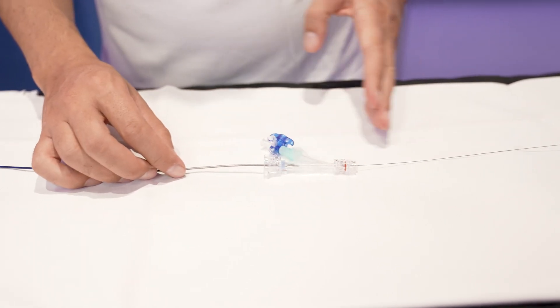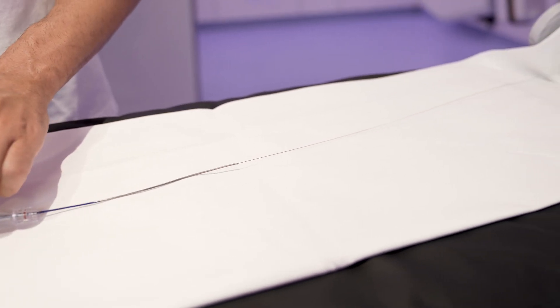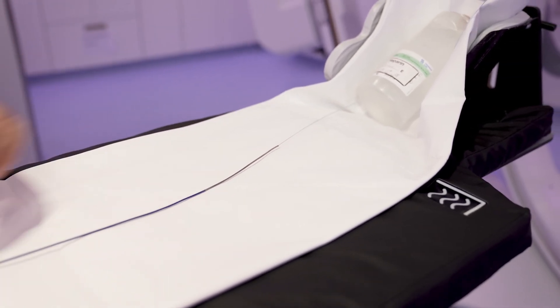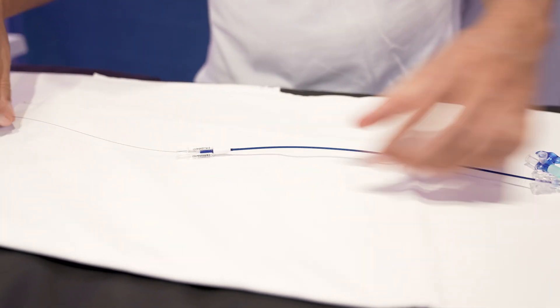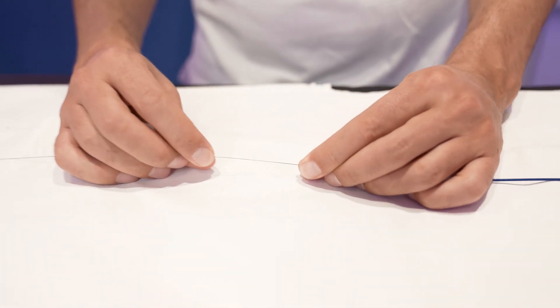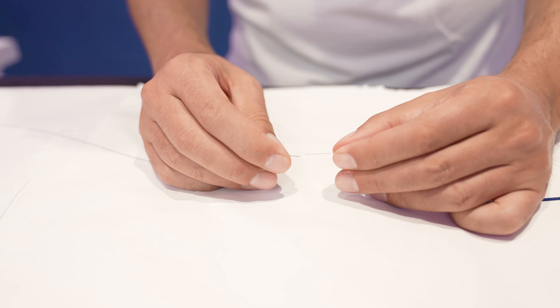As you can see, we can now secure the wire there and I can now safely introduce the aspiration catheter. As I'm pushing, you see there is no force on the wire and we have a stable positioning of the stent retriever in the brain. This is now being done safely — you can go all the way to the clot and then do your thrombectomy maneuver. If for whatever reason you want to disconnect the wire, you can do this — I'll push it all the way until I have the connection part here, and now I'm disconnecting it.